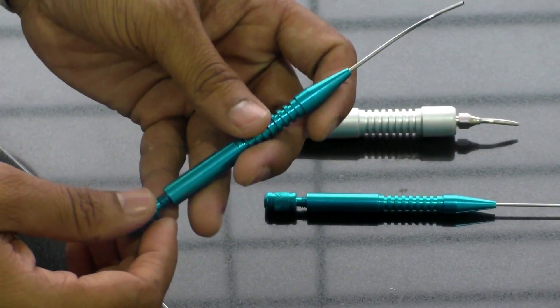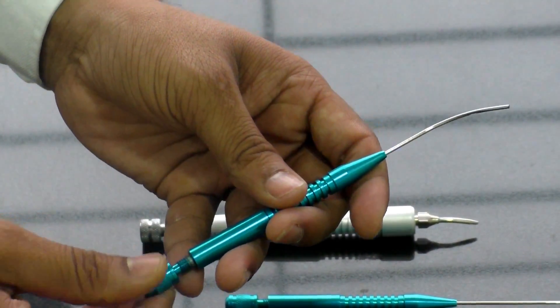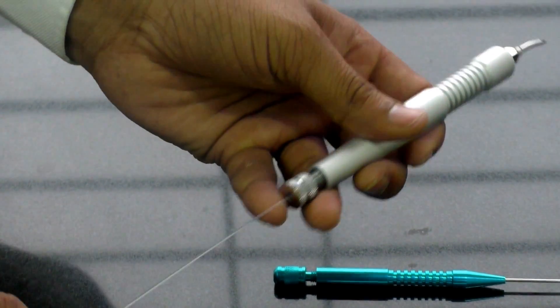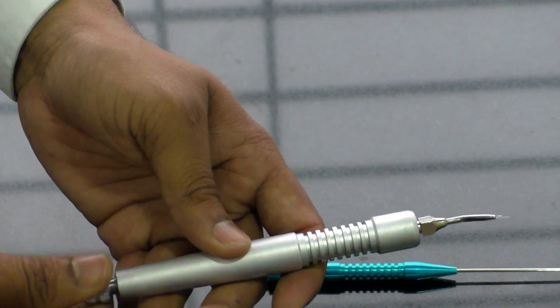So what we usually do is, we usually take out the screw for around 70% and we will be penetrating through these holes which are made and this fiber is ready to be used.